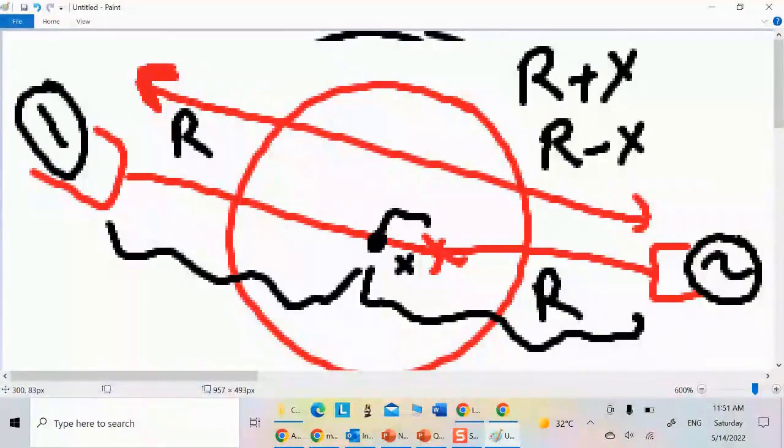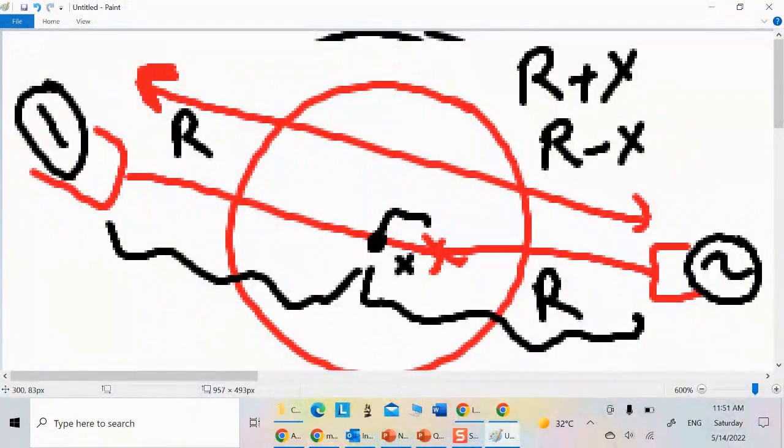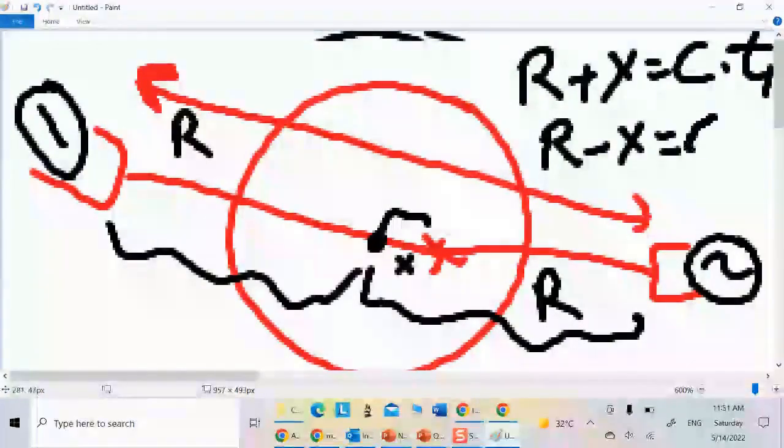Did the doctors understand it, or was it a problem? Okay, so this distance is a bit longer. What does the distance equal? A photon is like light. The speed of light, C, is about 300,000 kilometers per second. So distance equals speed times time. What is this time? The time of arrival of the photon at detector 1 will be called T1, and the second one T2.